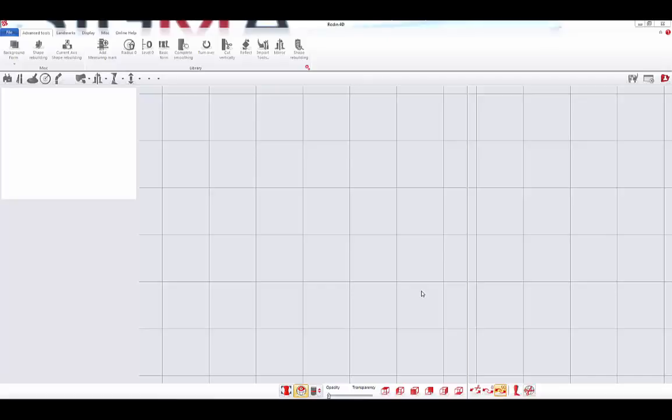Welcome to the new Rodin 4D Neo software. This video will make you discover the new interface of Rodin 4D with its more than 50 new functionalities.